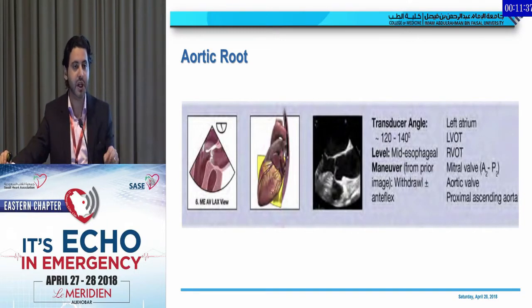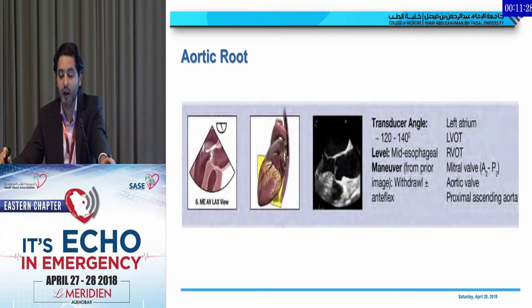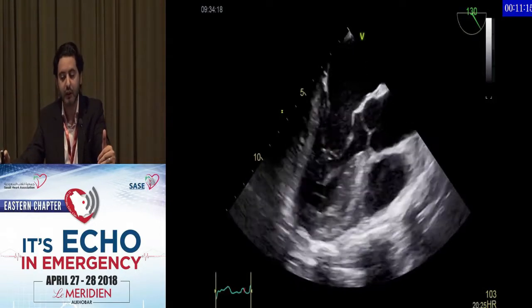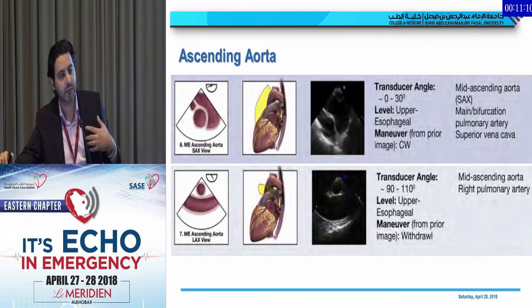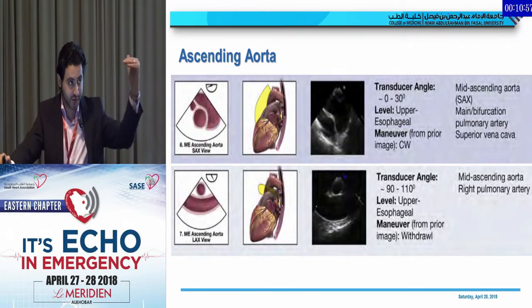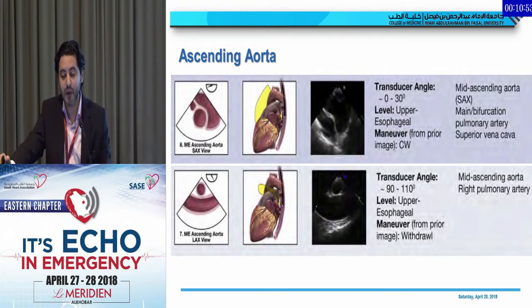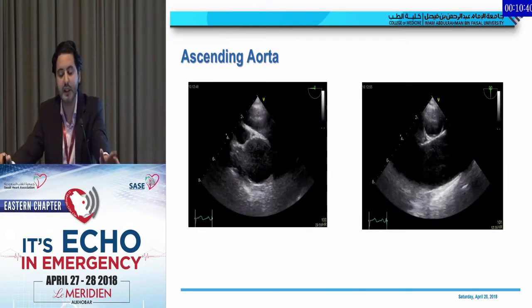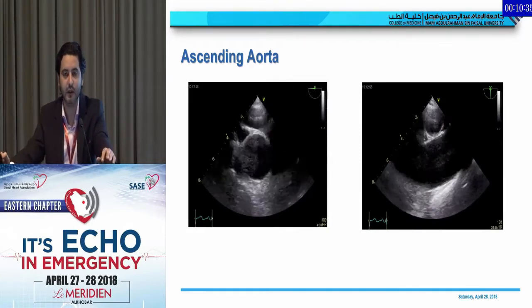For the aortic root, the best view is mid-esophageal at an angle of 120 to 140 degrees. For the ascending aorta, it is upper esophageal — angle zero for short axis, 90 for long axis. I keep the ascending aorta and arch until the end during TEE because it's not comfortable for the patient. Sometimes it's tricky for the aortic arch and ascending aorta because the trachea comes in between. This is an example of a normal ascending aorta: short axis on the left, long axis on the right.